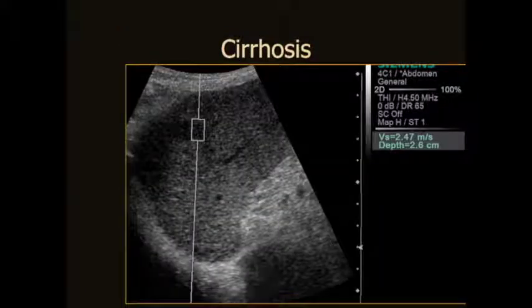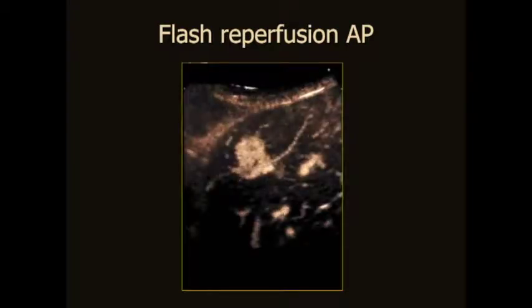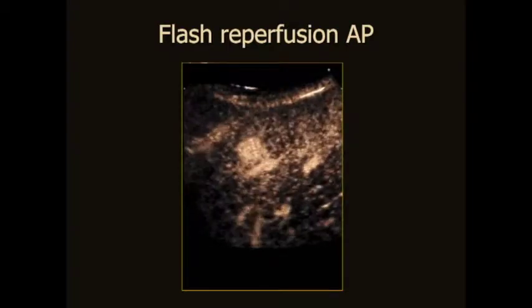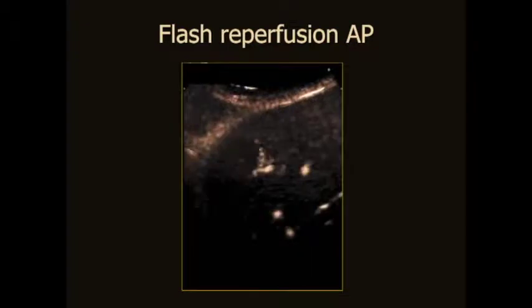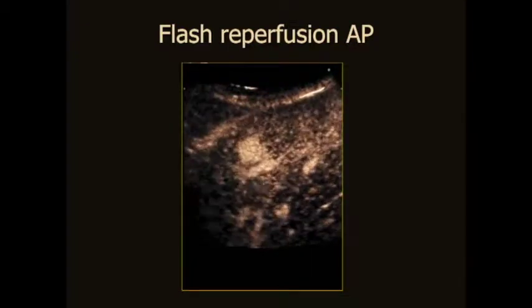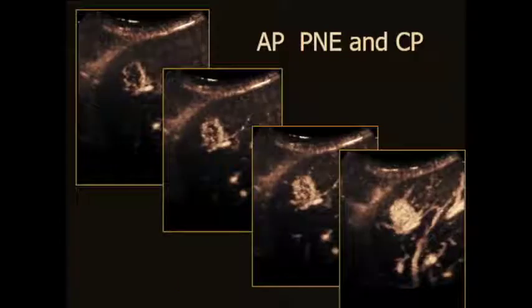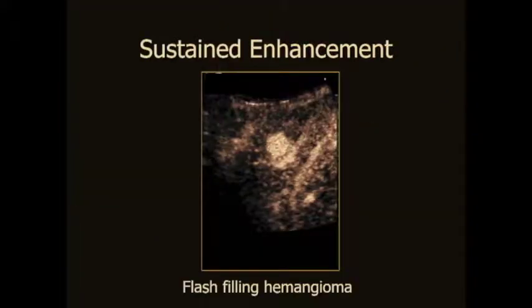We confirm always the cirrhosis with elastography, and there, when we are using bubble tracking technique, we can see that this is definitely a lesion which has peripheral puddles and rapidly fills to the center, and confirm unquestionably that this is a flash-filling hemangioma. And we back up within that clip and can extract these really exquisite images showing the enhancement pattern of this benign lesion.